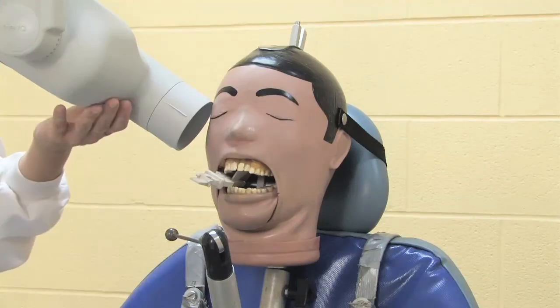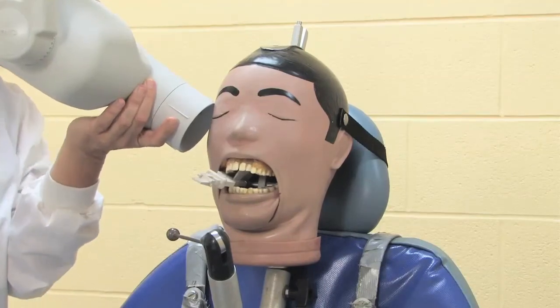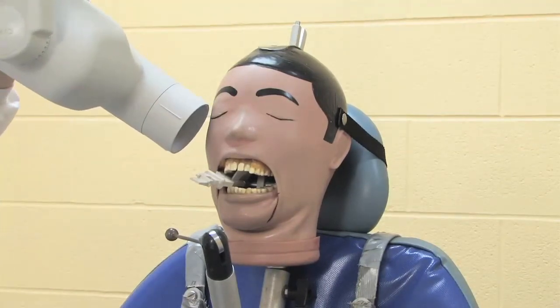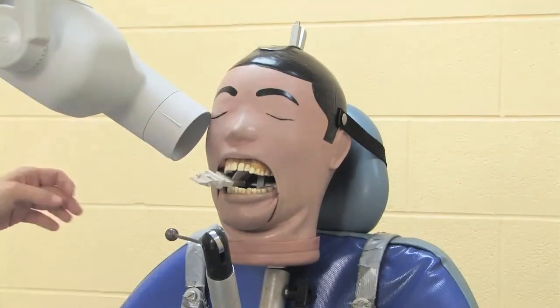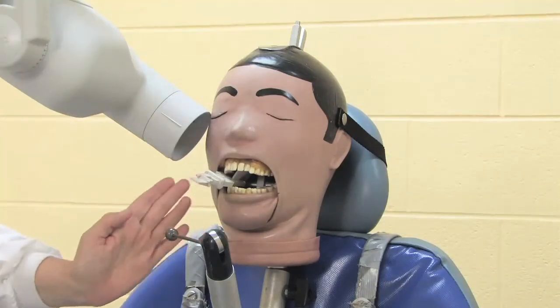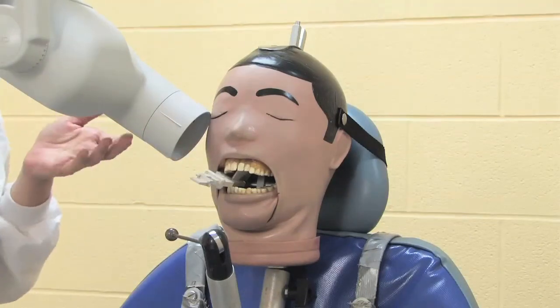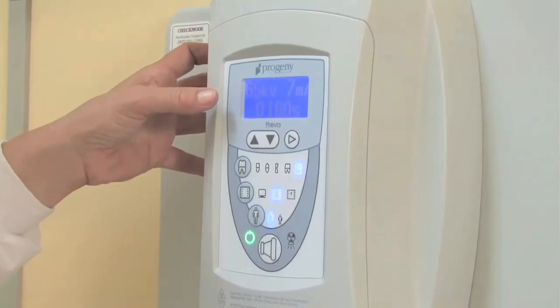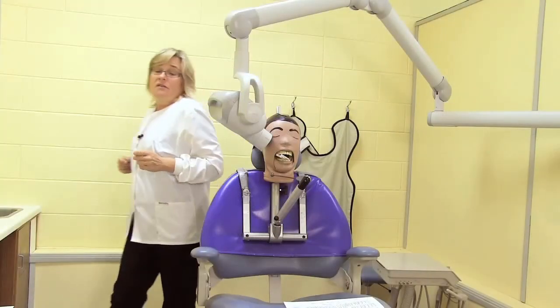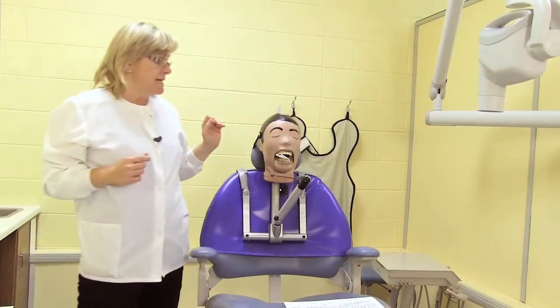So when I look at my angulation here, it's at about 25 degrees for the maxillary molar shot. Line it up, make sure that the film is covered by the PID. Make sure that my PID is flush with the base of the snap array bite tab. It's aligned with the film. As I said, the angulation is about 25 degrees. And then I have to make sure that I change my setting. And I go all the way to the last setting, which would be the maxillary molar setting, and take my shot. So in conclusion, that would be the maxillary bisecting technique.